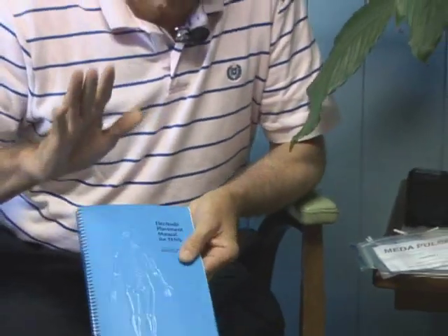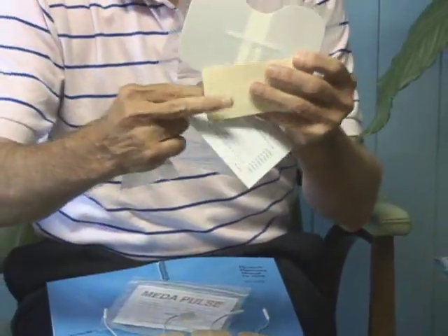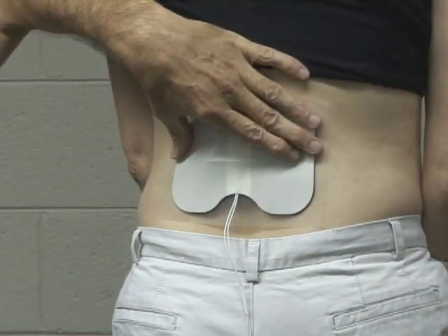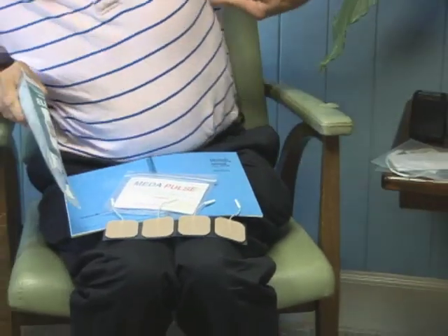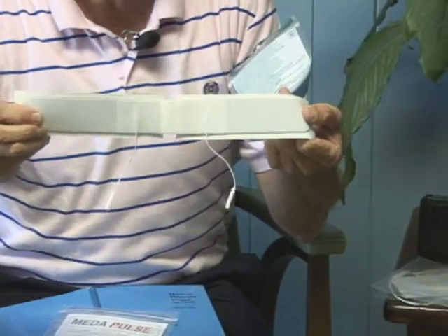I want to explain the only purpose of electrodes. You have an electrode of any shape or size. When somebody gets a TENS unit, they usually get an electrode that's like two by two. They may have a low back problem and get what's called a butterfly electrode — set up for the spine and each side. There's also large electrodes for someone who's had a thoracotomy, a big area, where you put one on each side and stimulate.